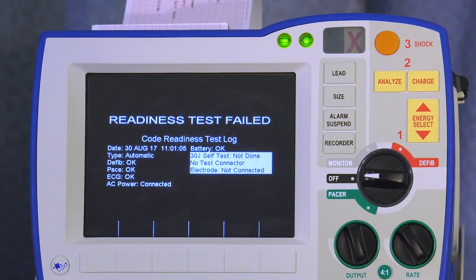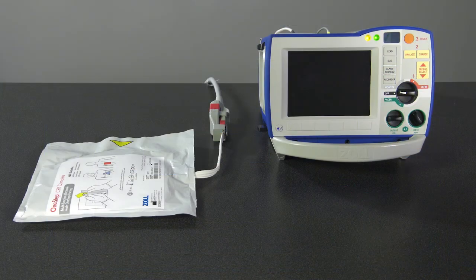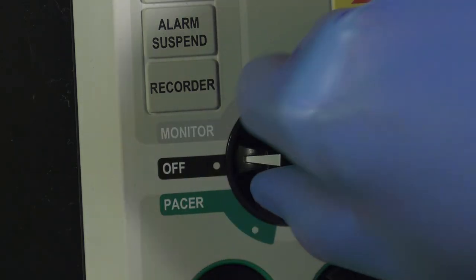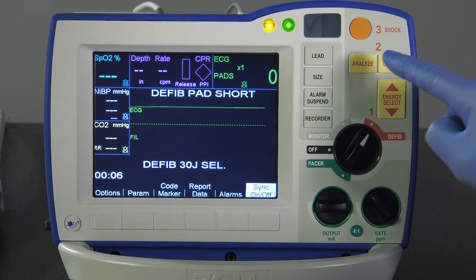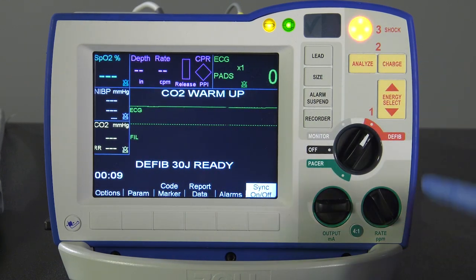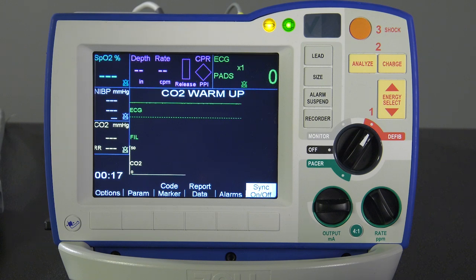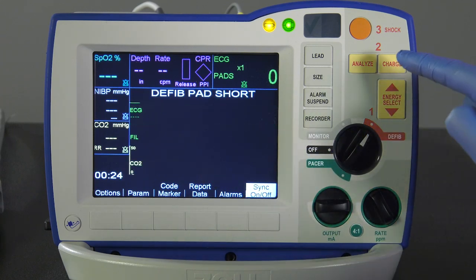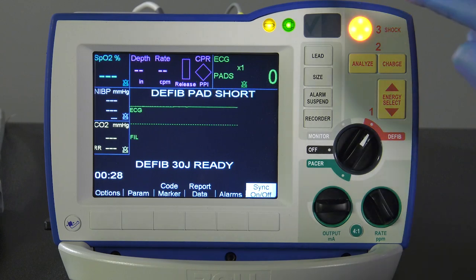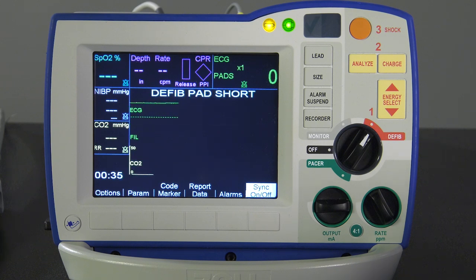If the red X still does not clear to a green check mark, call Clinical Engineering. To perform a manual test, ensure the one-step cable is plugged into either one-step electrodes, paddles, or the test port. Turn the mode selector to defib. Set the energy to 30 joules and press charge. When the charge-ready tone sounds, press the down energy select button until 20 joules is reached. The defibrillator will disarm itself. Press the energy select buttons to reset the energy to 30 joules, press the charge button, then press shock. The display should indicate Test OK. If this message does not show, notify Clinical Engineering.